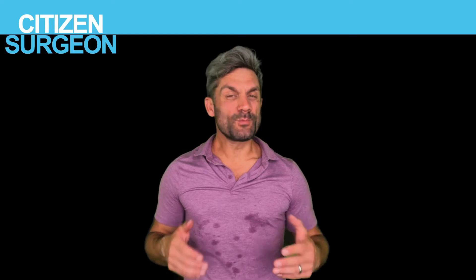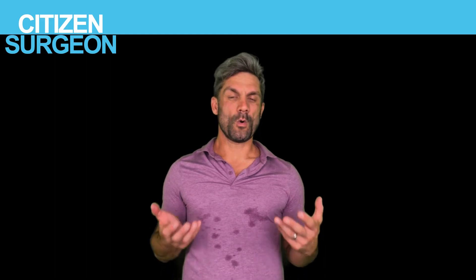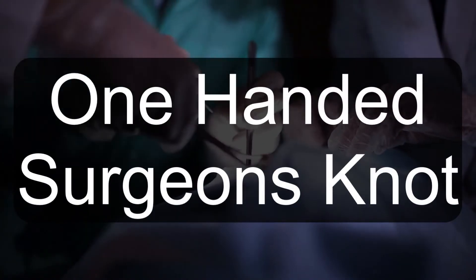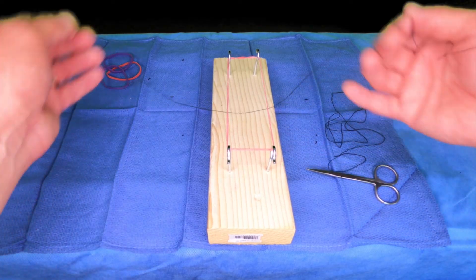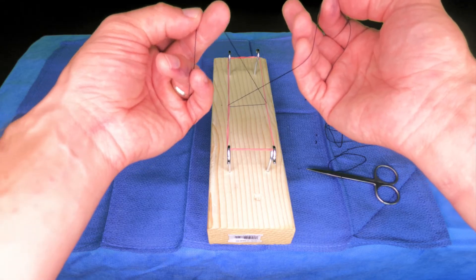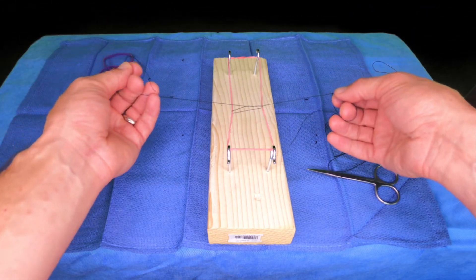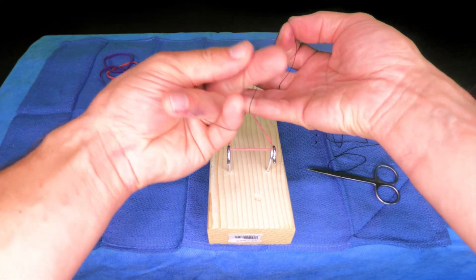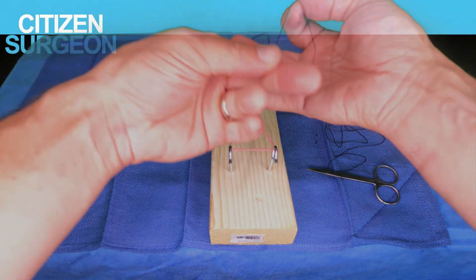We've learned all the knots and practiced the deep tying — now I'm going to show you the dreaded, infamous one-handed surgeon's knot. What you're going to do is perform a middle finger throw with one hand and an index finger throw with the other at the same time. When you do that, you're left with a surgeon's knot that's going to hold nice tension. So: middle finger throw and index finger throw simultaneously — boom, boom — gives you a nice surgeon's knot.